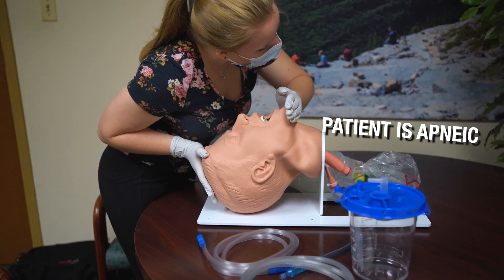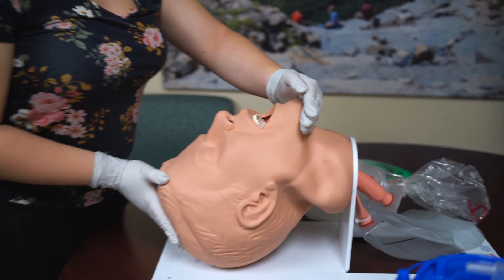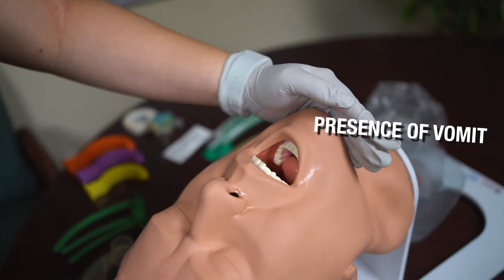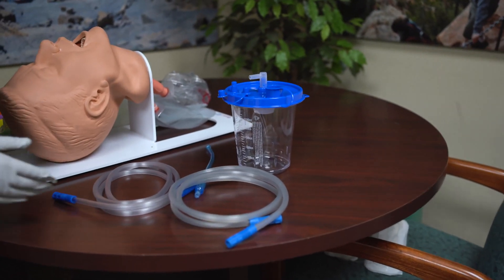I do not feel or see any breathing. So I'm going to look in the patient's airway to see if it's clear. I see vomit in the mouth, so I'm going to set up my suction device to clear the airway.